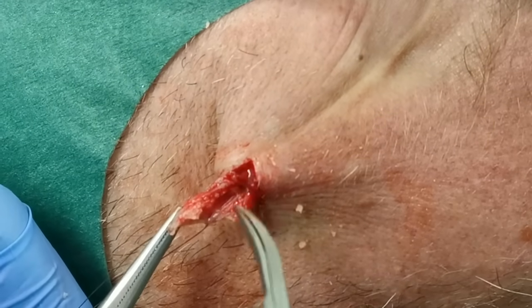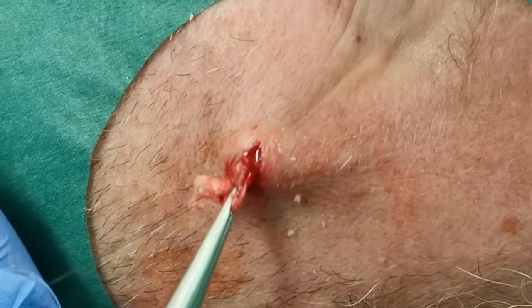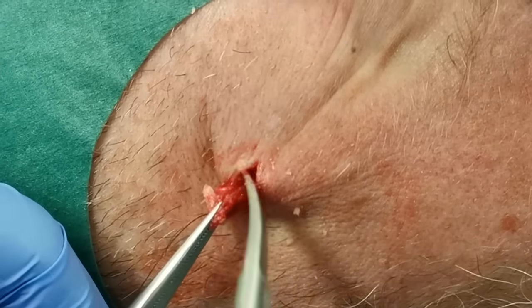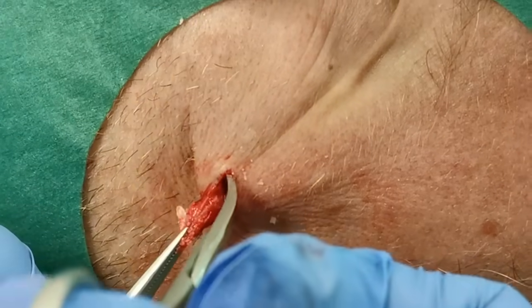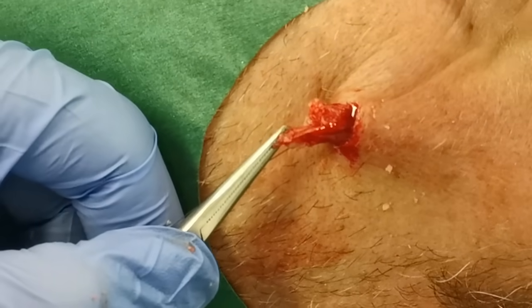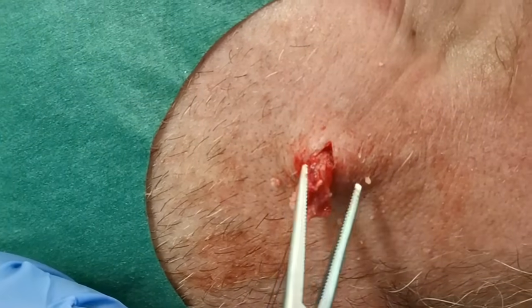So what I'm doing is I'm really trying to gently pull this little sac out. You can't see, but the camera people can see how very delicate and thin it is. You've got to be really patient. Can't go in and just chop it out like a lumberjack. You've got to really give it a bit of respect. Tissue respect is really important when it comes to surgery.